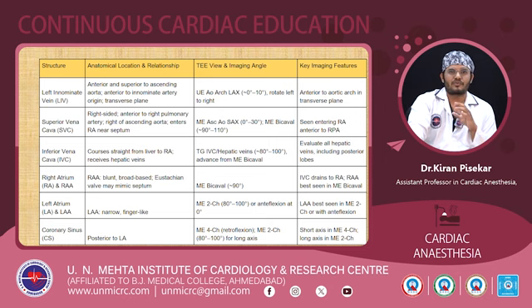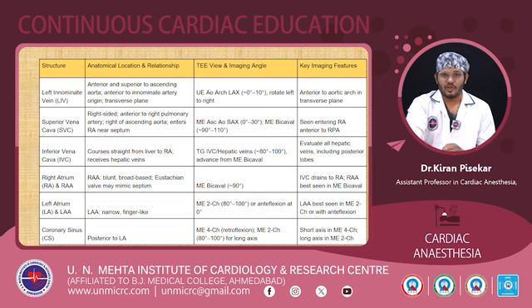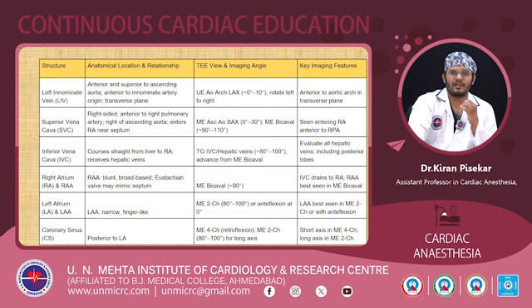The inferior vena cava courses straight from the liver to the RA, and during this course it receives the hepatic veins. We can visualize the IVC in the transgastric IVC or hepatic view, which is a modified view, by advancing the probe from the mid-esophageal bicaval view, and we'll get this structure at 80 to 100 degree multiplane angle. We can evaluate all hepatic veins including the posterior lobe hepatic vein. The posterior lobe hepatic vein can be missed, so we need clear attention while visualizing this.